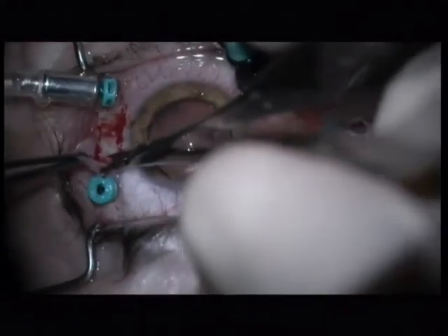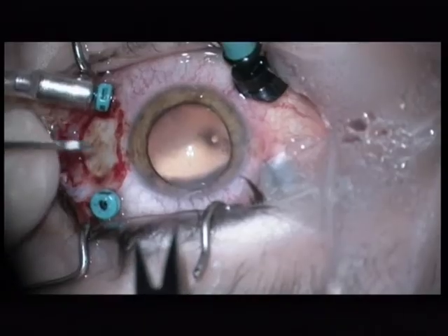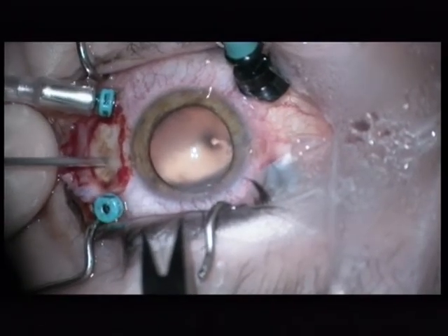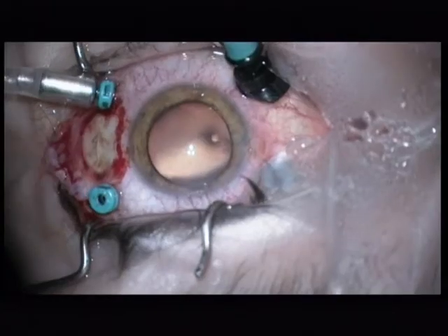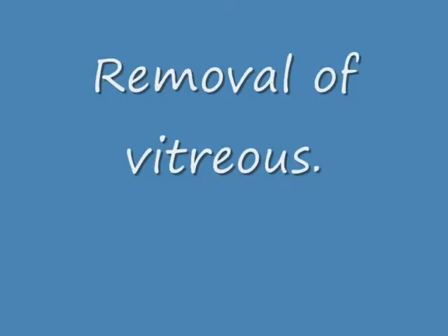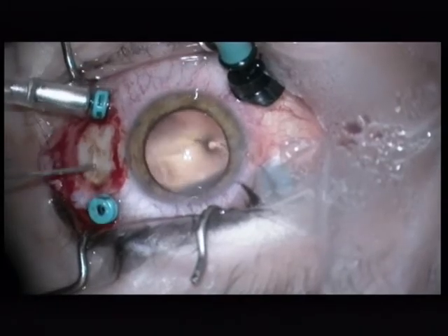So a limbal peritomy on the opposite side. This has to be done in any case because the foreign body is far too big for the trocars. You have to measure the right distance — 4 mm behind the limbus — using a V-Lance from Alcon. I remove some anterior vitreous which is located behind the sclerotomy.